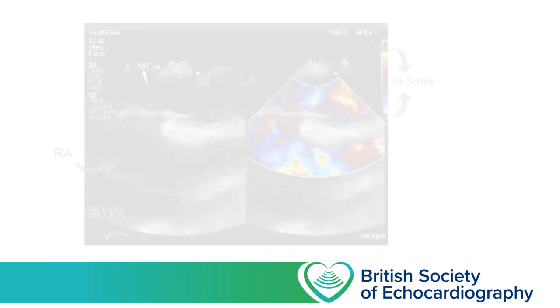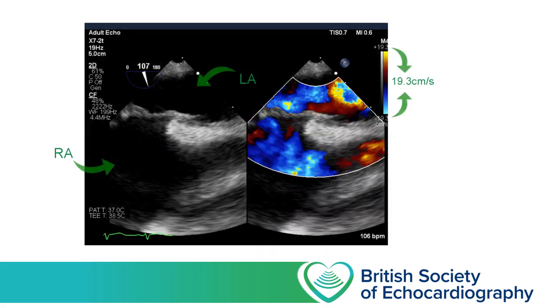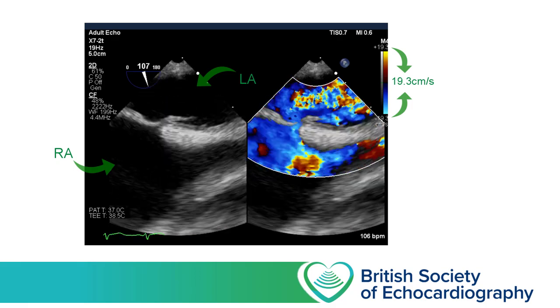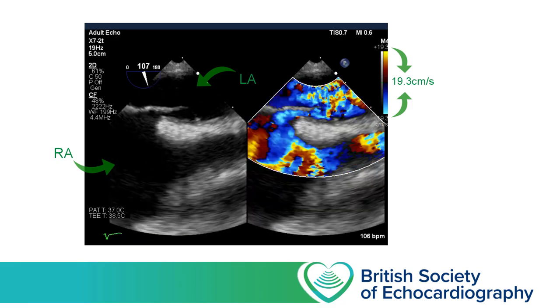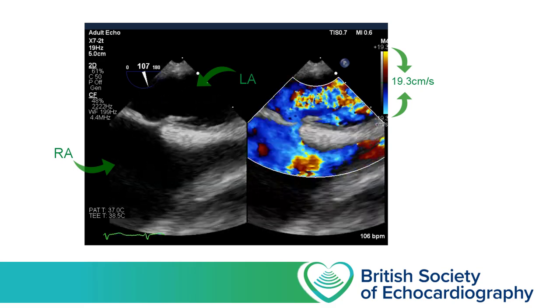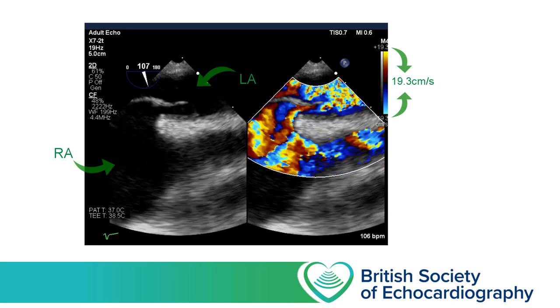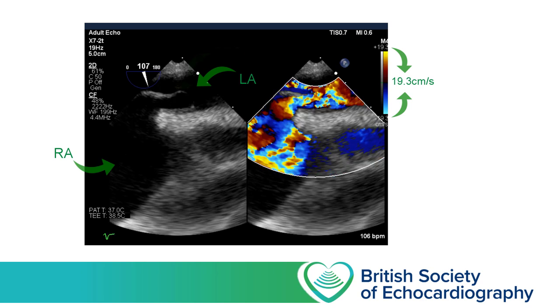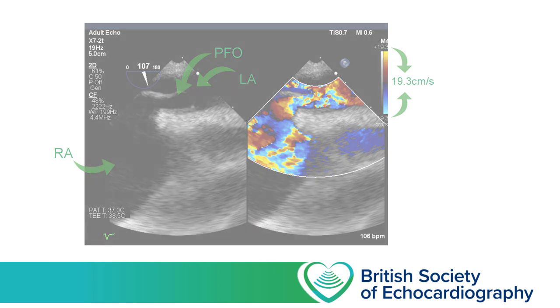Whilst we can't turn the scale up beyond the Nyquist limit, we can decrease the portion of the scale we're using if we're looking for particularly slow flow. In focused echo we rarely have to do this, but you should be aware it is possible. One situation where this is useful in comprehensive studies is to look for flow between the atria. Here we have a TOE bicaval view where the left atrium is in the near field and the right atrium in the far field. Flow between the atria is often relatively slow, so turning the scale down better demonstrates this PFO.